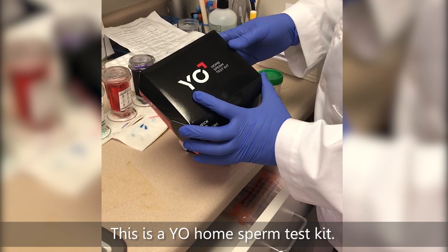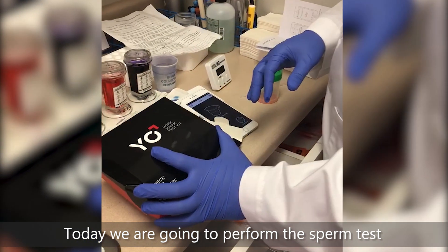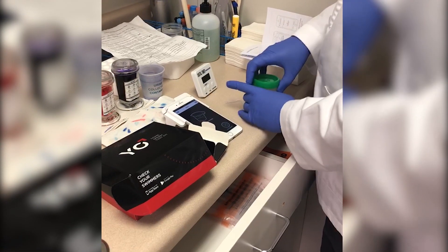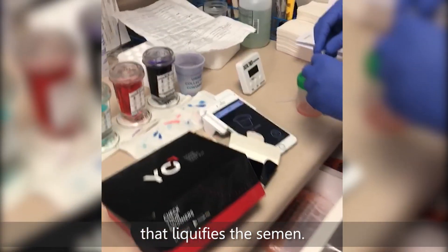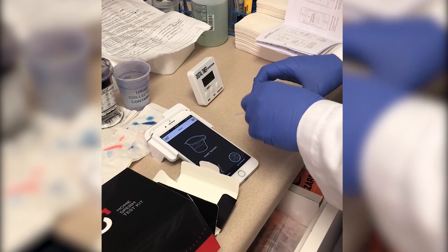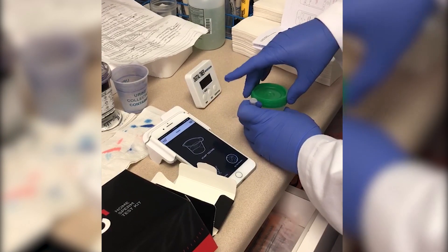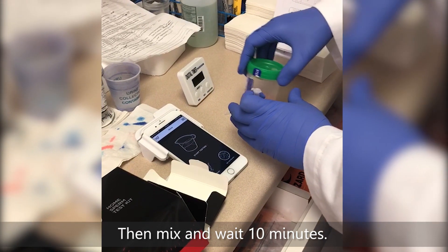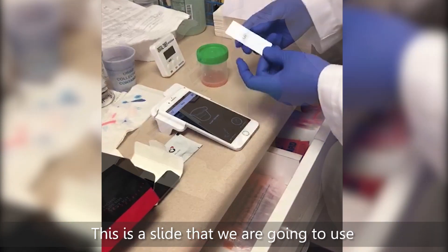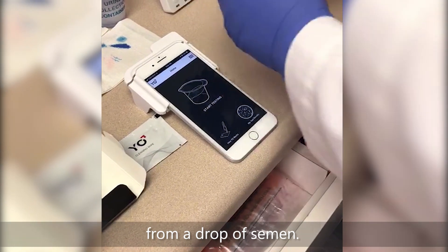This is a YO home sperm test kit. Today we're going to perform a sperm test. We have a sample collected at 8:30 a.m., about 30 minutes ago. Now I'm going to put in the powder that liquefies the semen — you can just mix and wait 10 minutes. This is the slide we're going to use to measure; I'm going to put a drop of semen on it.